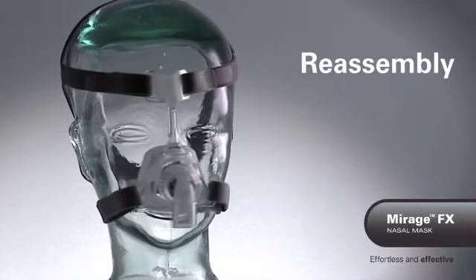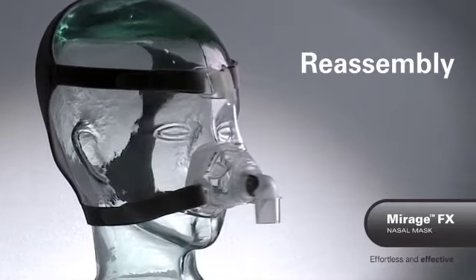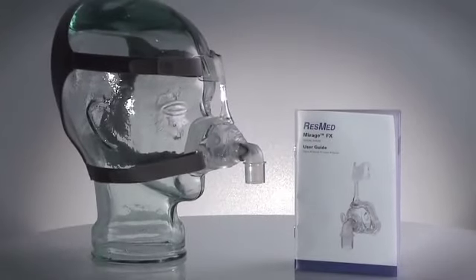When all components are dry, reassemble your mask ready for use. Reassembling the Mirage FX is very easy, but if you are ever unsure, you can refer to your user guide for step-by-step instructions.